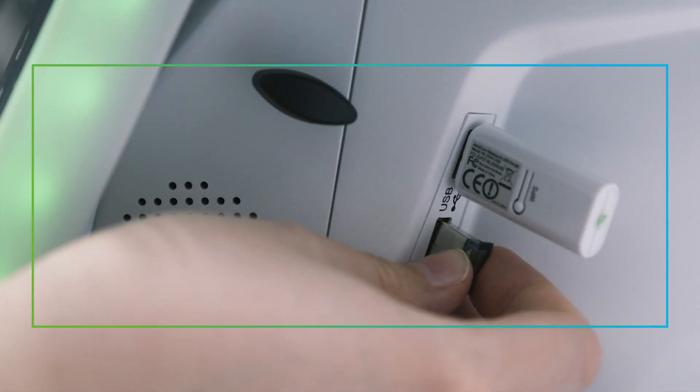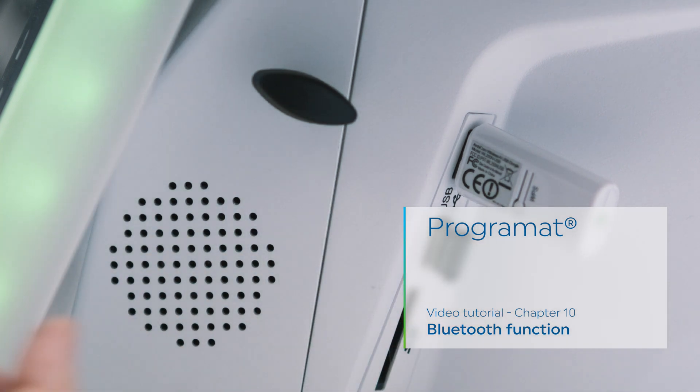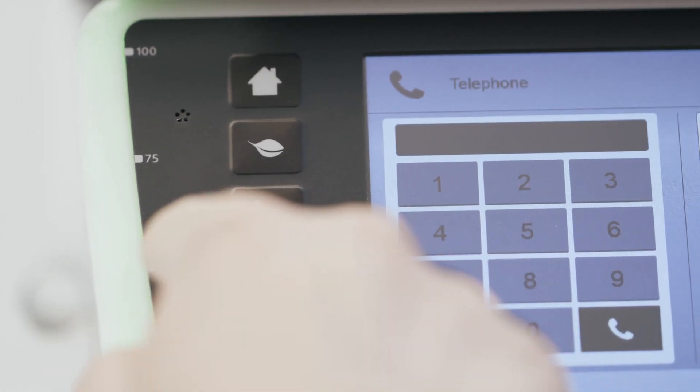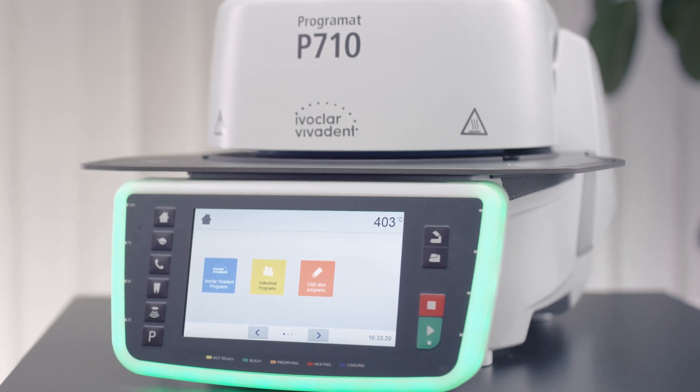Programat Video Tutorial Chapter 10: Bluetooth Function. In this chapter, you will learn how to configure the Bluetooth function of your Programat furnace and use your furnace to make phone calls. Please note that only certain Programat furnaces of the latest generation offer this functionality.